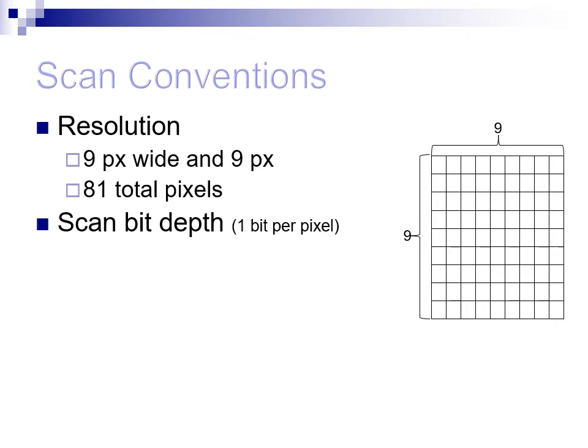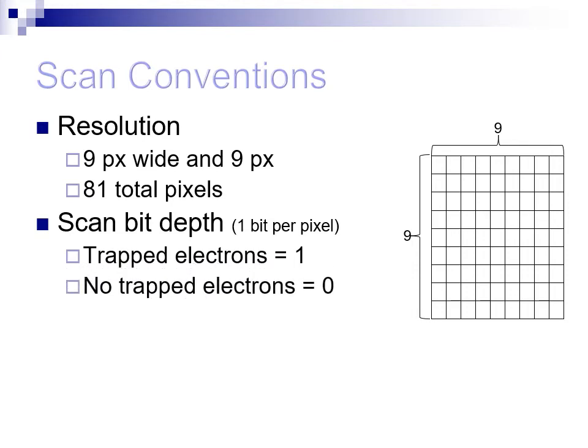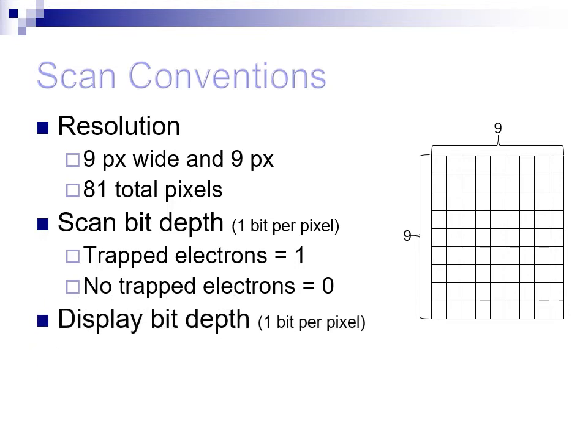Furthermore, to keep our example simple, we will only devote 1 bit or memory location to each pixel. Pixels with more than 50% of their crystals producing light will have a 1 assigned to their memory location. Any pixels that don't meet the 50% threshold will have 0 applied to their memory location. Since one memory location is used to store image data, only one memory location is needed to display the image on a screen. Any pixel memory location containing a 1 will be displayed as black, and any pixel memory location containing a 0 will be displayed as white.